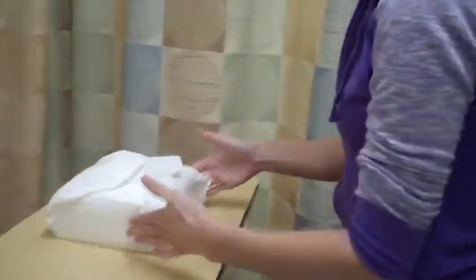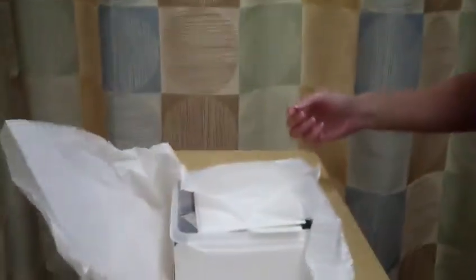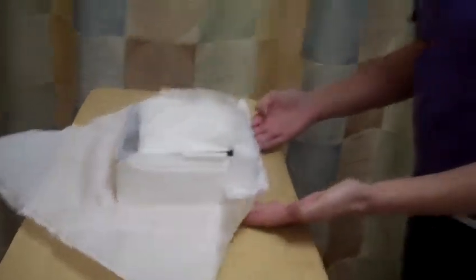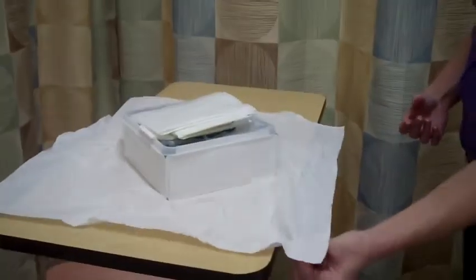Actually, I'm going to open this up. I'm going to pick up all my materials now. Going to pull out this drape. Set this on the table without any personal belongings there so I can take my measurement later.